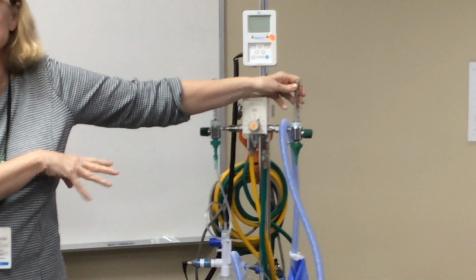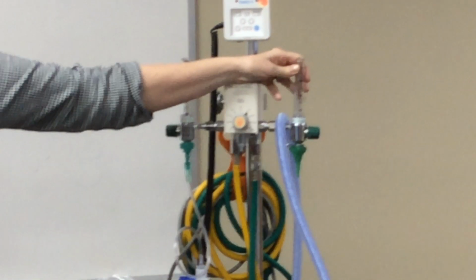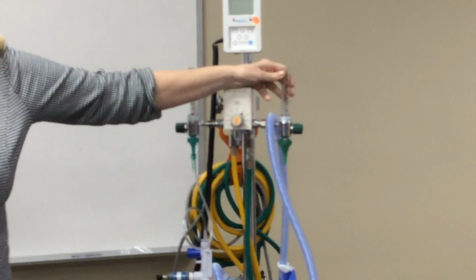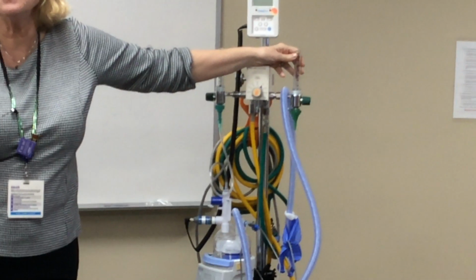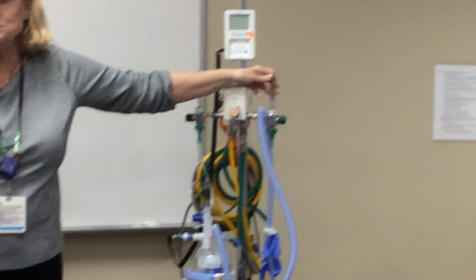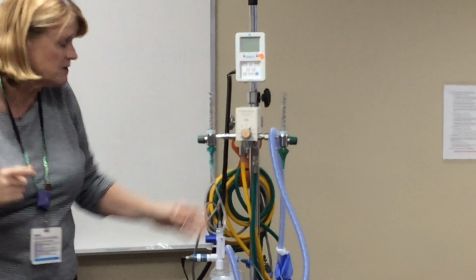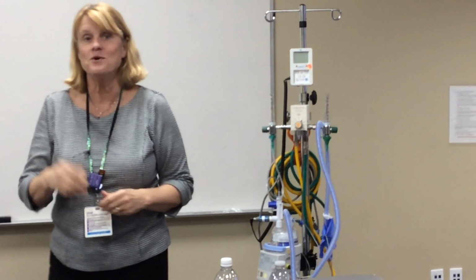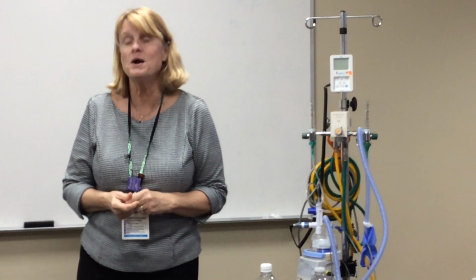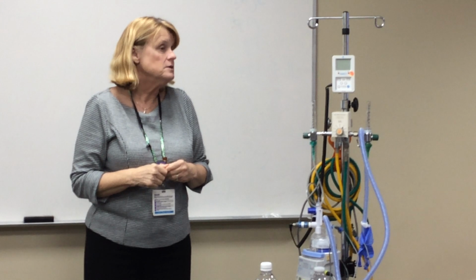over. So this could be the ICU. The ICU sometimes goes up that high, because remember, if you have a kid that comes in who is, let's just say, 14 or 15, and has really bad pneumonia and qualifies, you may be using this device. There's a larger tubing, and it's actually a larger board here, and the adult sizes can go up to 60 liters per minute, and you'll probably see that in your time here.